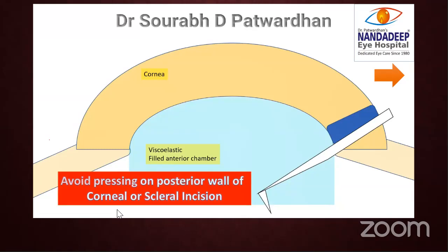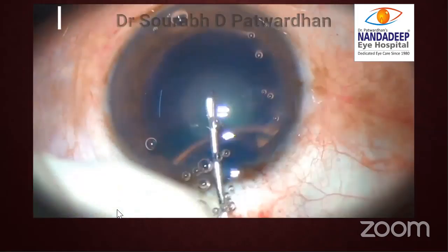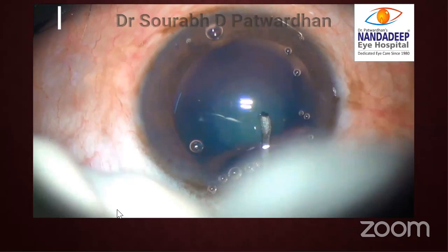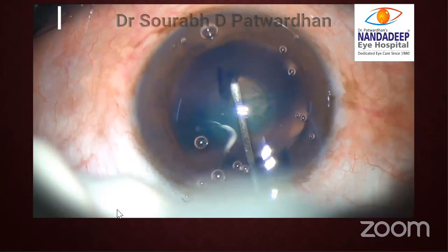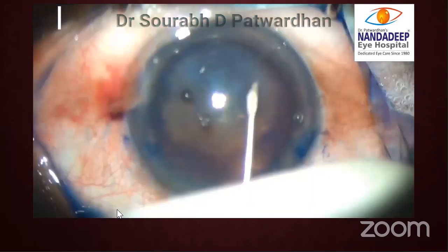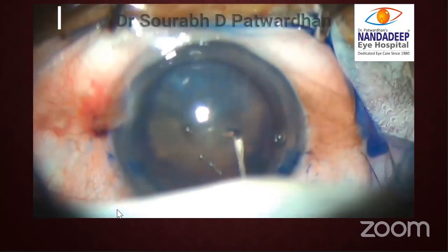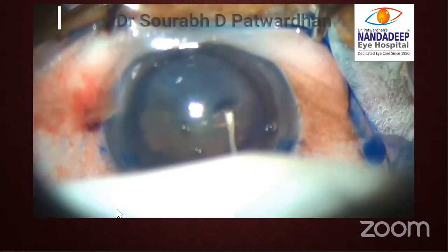The other side of it is that for other movements, like for example, when you are doing hydrodissection, you may purposefully press the posterior lip to allow the fluid to come out. So just watch here how the surgeon is doing, and you can see that he's constantly pressing the posterior lip, and you can see the visco is slowly leaking out. When the visco starts leaking out, you can see the bubble movement which is going out. That means the visco is leaking from the anterior chamber.